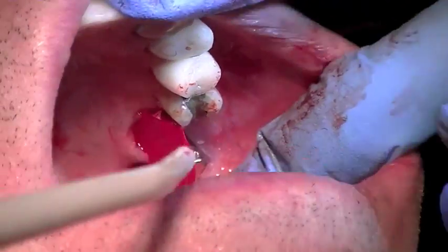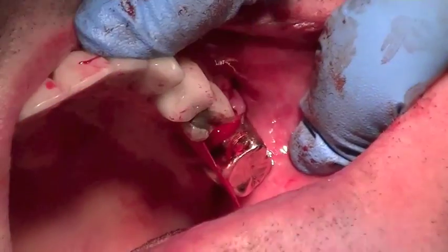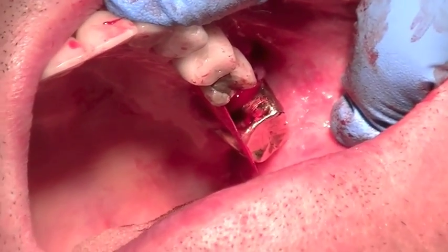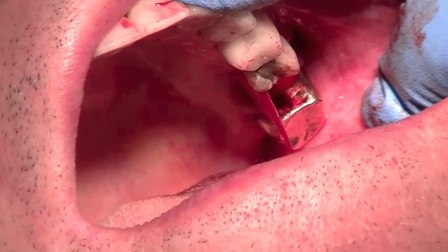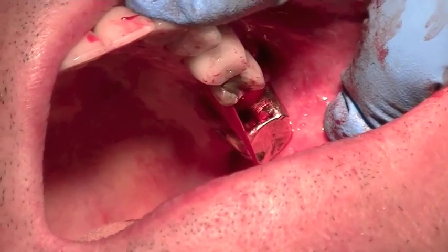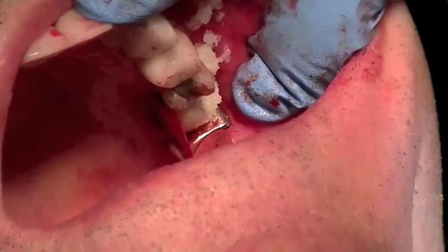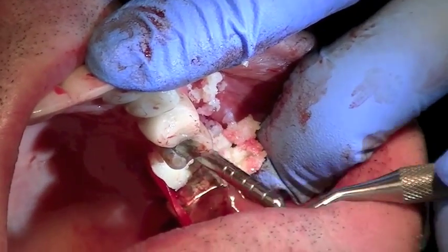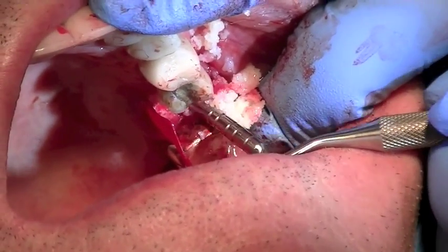You can see now that I can pull my membrane back a little bit and I have a nice little envelope or a window here to pack my bone. I'm going to use a putty — it's a combination of demineralized cortical bone and mineralized cancellous bone — and I'm able to inject it right into the socket. When you're placing your bone, remember that you don't want to pack it as hard as you pack amalgam. You don't want to crush those bone particles and pack them too tightly.